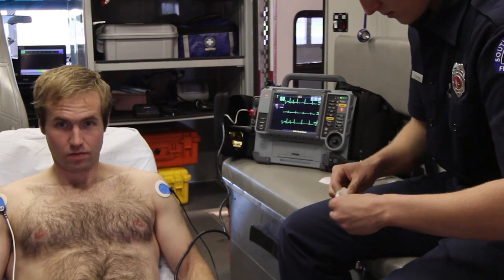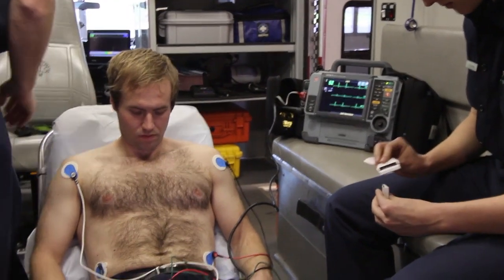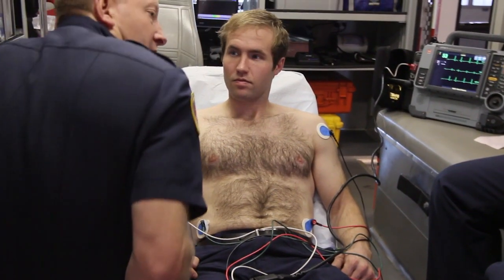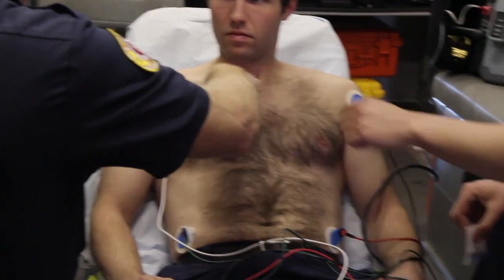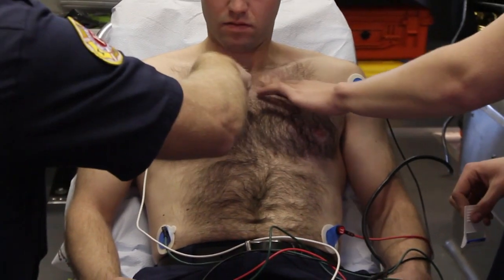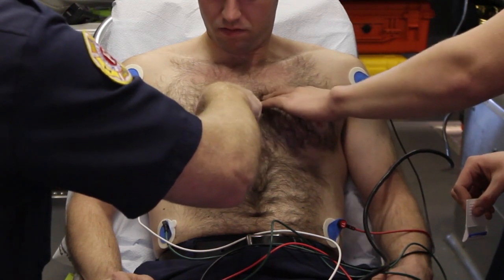As you get ready to shave, we're thinking that we need this to be in the fourth intercostal space on either side of the sternum, which is going to be right there. If you reach up here, you're able to feel kind of a divot in, and the next one you come to is the second intercostal space, third intercostal space, and fourth intercostal space.